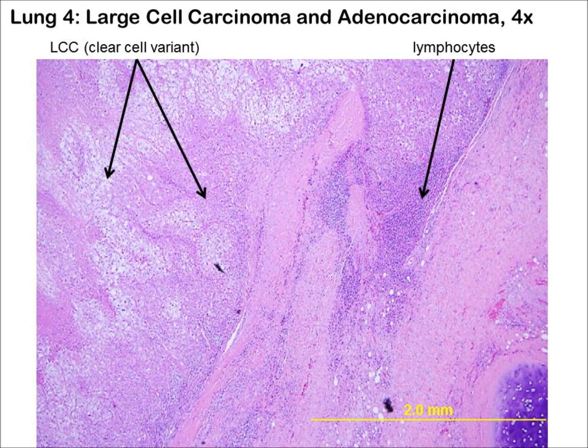Switch back to low magnification and scan the large tumor mass and note the following. First, the border between the tumor and the normal tissue is indistinct due to a heavy infiltration of lymphocytes. Clearly, the tumor is stimulating an immune response. And secondly, while the tumor mass is large, there is only a thin rim of actively growing cells around the edge, and this is mixed with the lymphocytes.